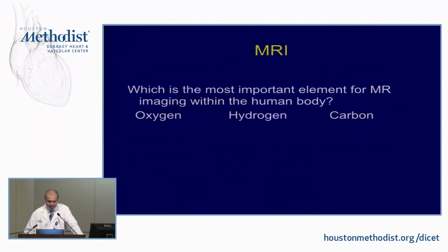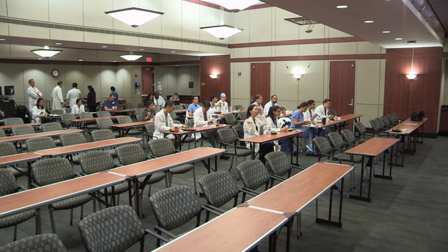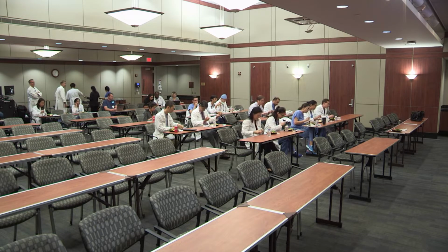Another question for you guys: for MRI imaging, which is the most important element in the human body? Is it oxygen, is it hydrogen, or is it carbon? How many think it's oxygen? Raise your hand. Okay, nobody. Good. How many think it's hydrogen? Raise your hand. It looks like almost everybody. How many think it's carbon?